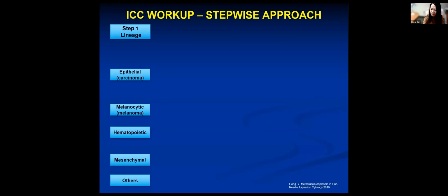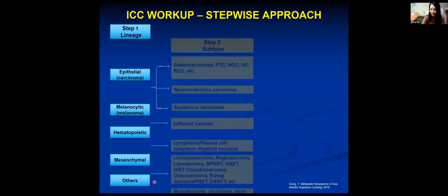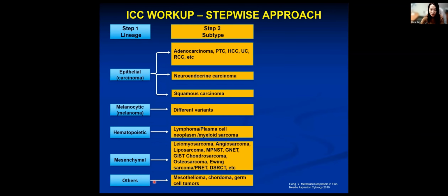We aim to identify the lineage origin of the tumor cells among epithelial, melanocytic, hematopoietic, mesenchymal, and some other rare tumors.